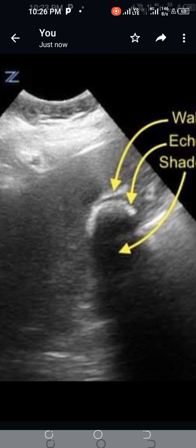What is the importance of the Wall Echo Shadow sign? This sign represents a contracted gallbladder with multiple stones in it — that is, it represents cholelithiasis.